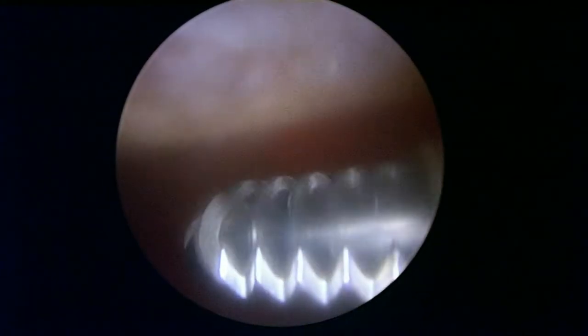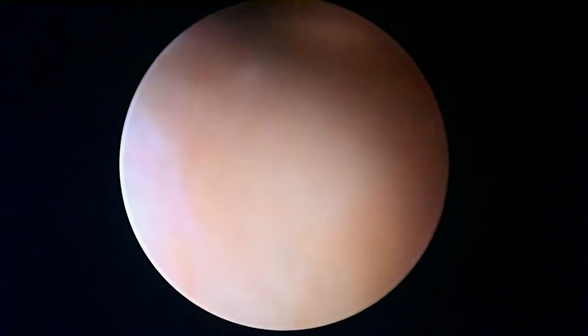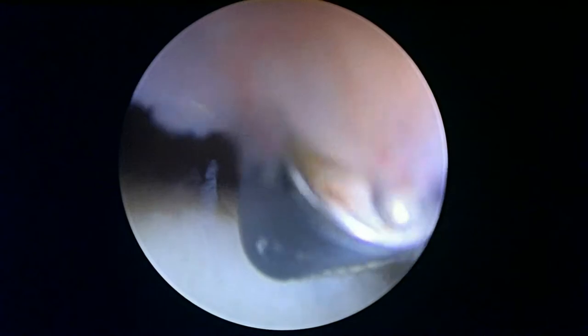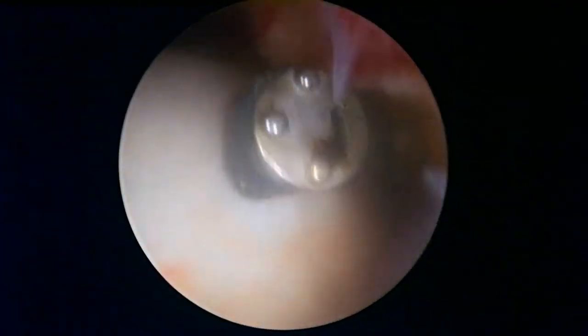We're looking here at the patella at the top of the screen. As you would suspect, there are areas where it's missing a fair amount of cartilage. Coming down the trochlea, it's not too bad here, but the most remarkable thing is the incredible vascularity — your knee has been trying really hard to deal with this problem. It's been very inflamed and the joint capsule or synovium has been very inflamed. We're just trying to control that a little bit.